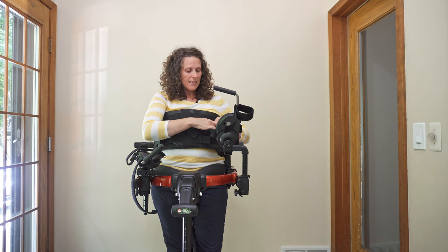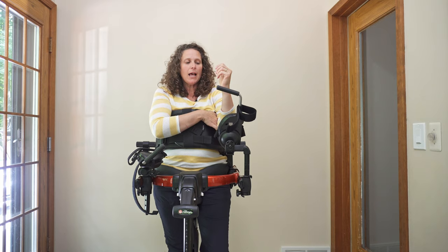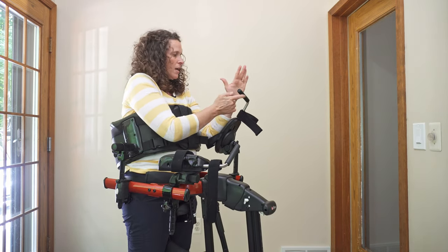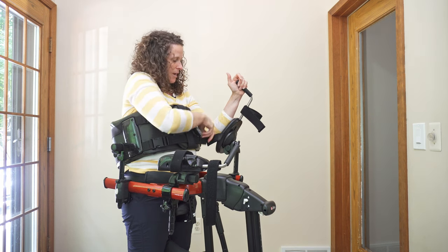I'm going to go ahead and take this strap here, put it through the loop and tighten it so it's just touching the velcro. Now what I can do is just slide my elbow in right there on that prompt, and adjust the handle so that my hand is right on there.